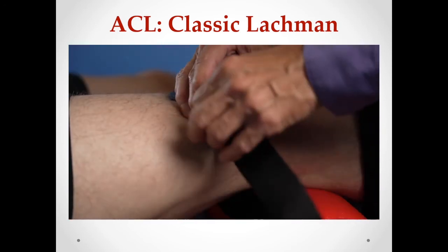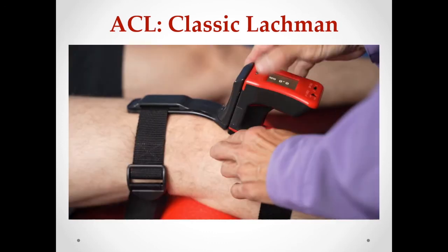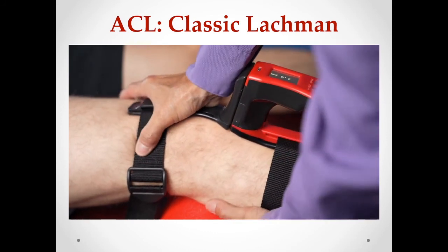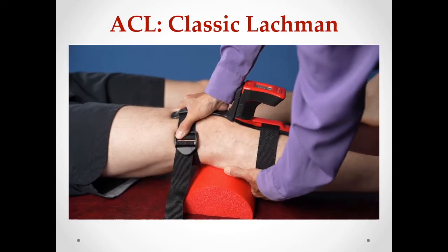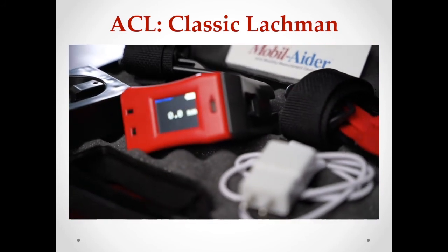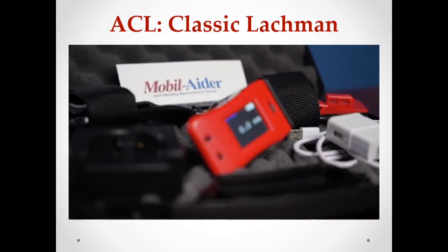placing the person's leg over the bolster for the recommended 30 degrees of knee flexion, and then strapping the device into place. Now the mismatch is no longer an issue. The hand proximally can just simply stabilize by pushing down. You don't have to grasp. And the distal hand can translate anteriorly the proximal aspect of the tibia.